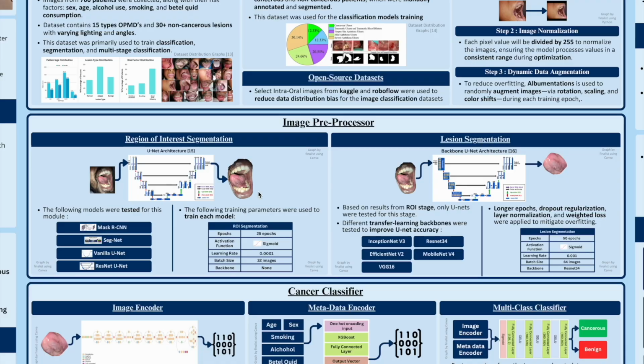On the architecture side of things, OralScan uses a first-of-its-kind multi-stage pipeline for pre-processing raw intraoral images. The initial model segments the oral cavity, then another model segments the suspicious lesions. This two-step approach improves accuracy by nearly 20%.